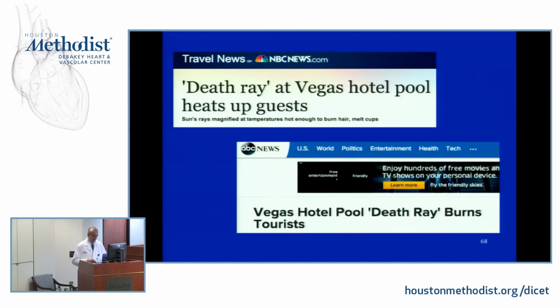So it's really a very specific set of conditions that are defined to say in these conditions this device can be safely imaged. So I'm going to take you to a little bit of an interesting story.